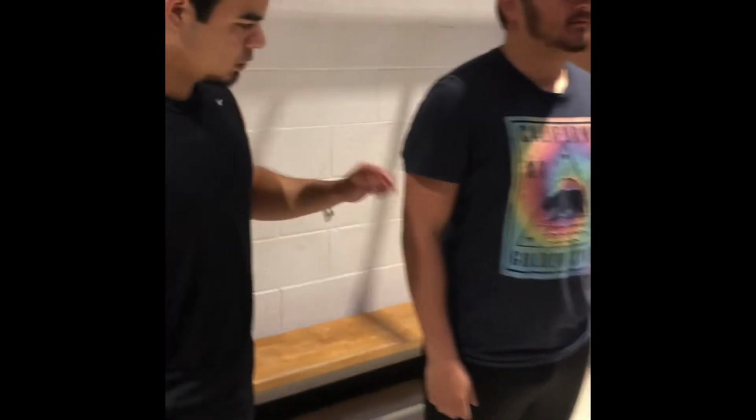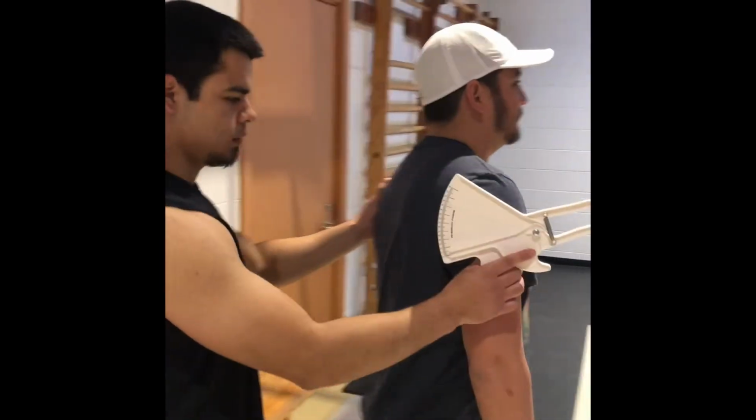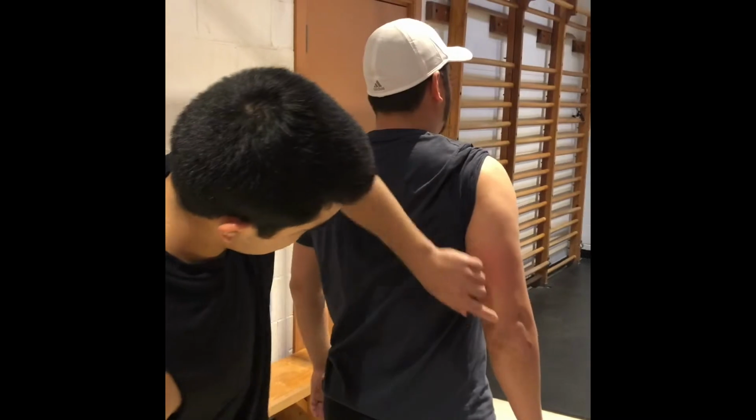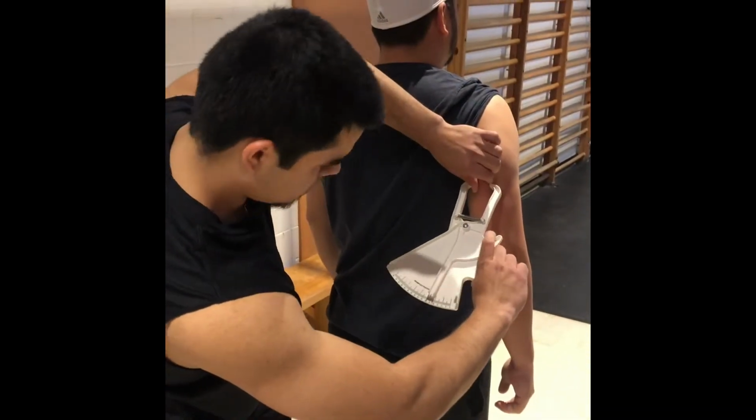The 7 sites to measure are the tricep, subscapular, mid-axillary, chest, abdominal, suprailiac, and thigh. Remember to place the calipers exactly 1 centimeter away from your thumb and index finger when measuring. Measuring the tricep is done on the posterior midline of the upper arm, halfway between the acromion and the olecranon process.